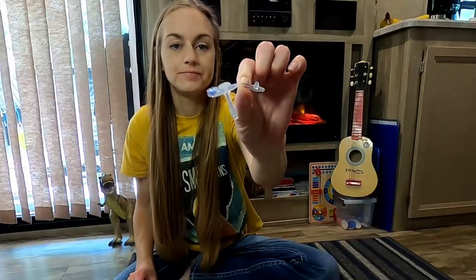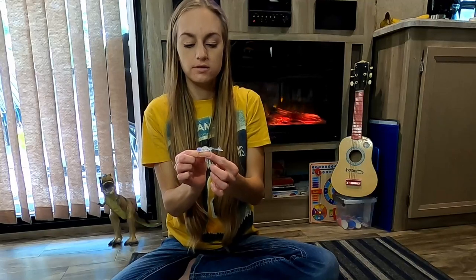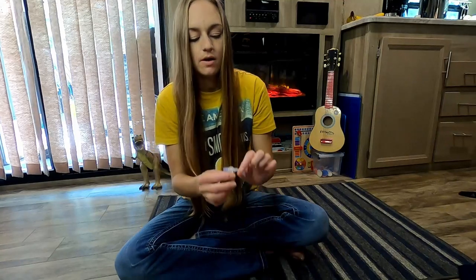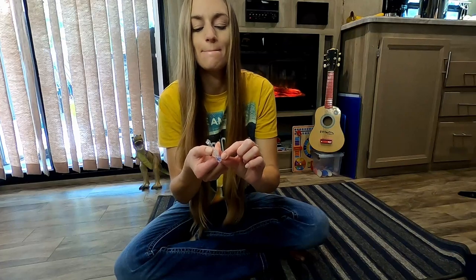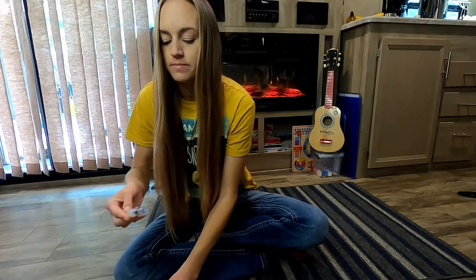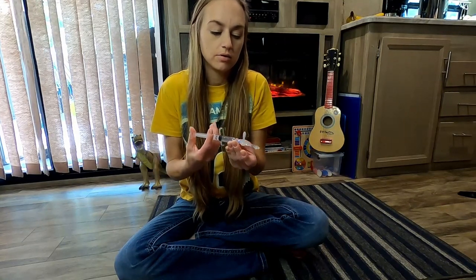And there's the button. I don't know if you can see that. That's the deflated button down here, where the little balloon will inflate. And that will go into his tummy. So then all you see is that outside. And that's what's in. No big deal. Right here on this little edge, this is where the syringe will go with the water. It says that it needs 4 mils. We will fill. Take 4 mils. And I always like to check the balloon.